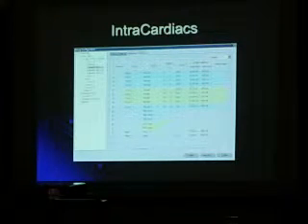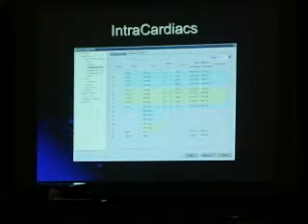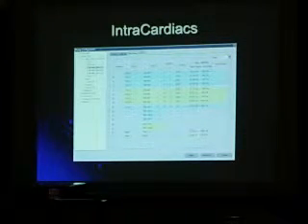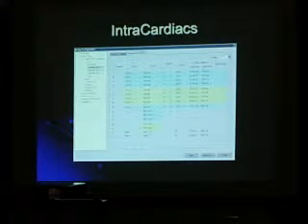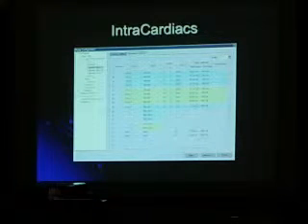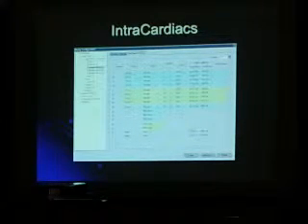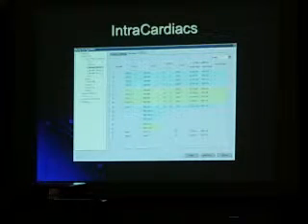So if you were doing AFib, you would put it back. With a lasso, it might be at 500. Though I have some very prominent AF centers that use only 150 for everything, and they say they have no problems. But I said this is science, and I believe in clinical, evidence-based medicine. I have no evidence. This is just an opinion. We haven't had a chance to publish, peer review, or anything like that. So use it at your own risk.